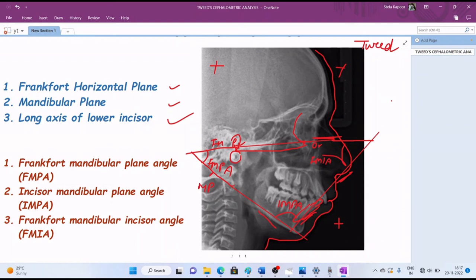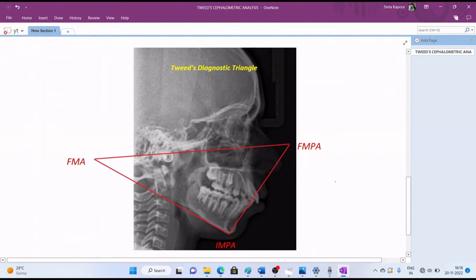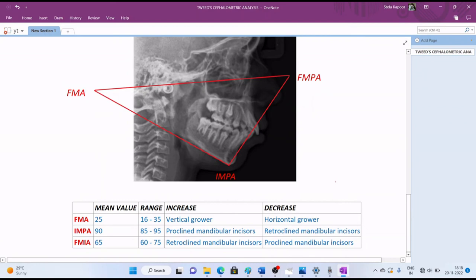Now let's have a look at the mean value and range of these angles, as well as the implications of increase or decrease in these values. First is the FMPA angle or the Frankfurt mandibular plane angle. The mean value of this angle is 25 with the range from 16 to 35 degrees. Any increase in this angle will indicate that the person is a vertical grower, while a decrease will indicate horizontal growth.